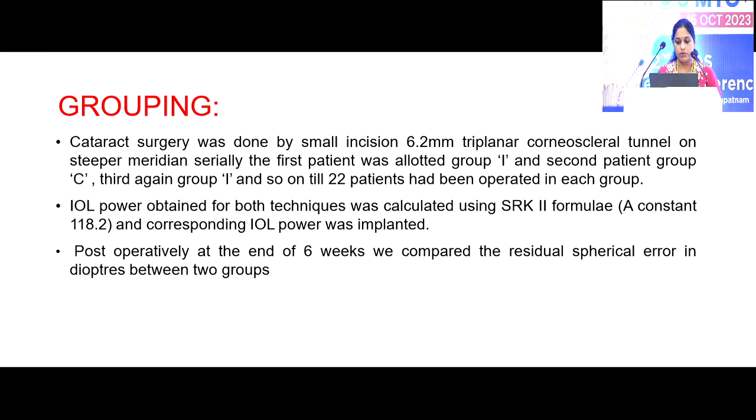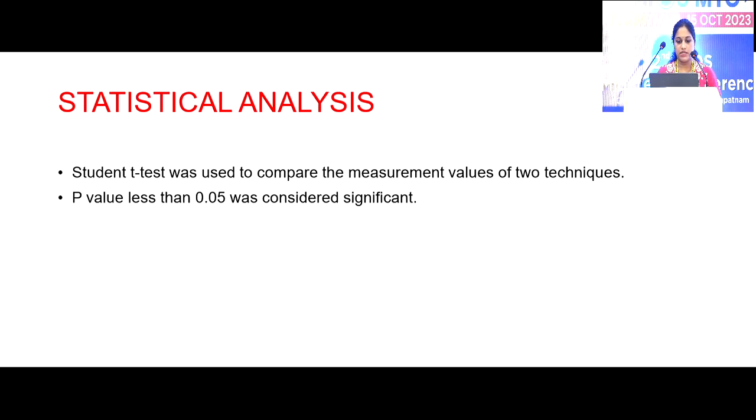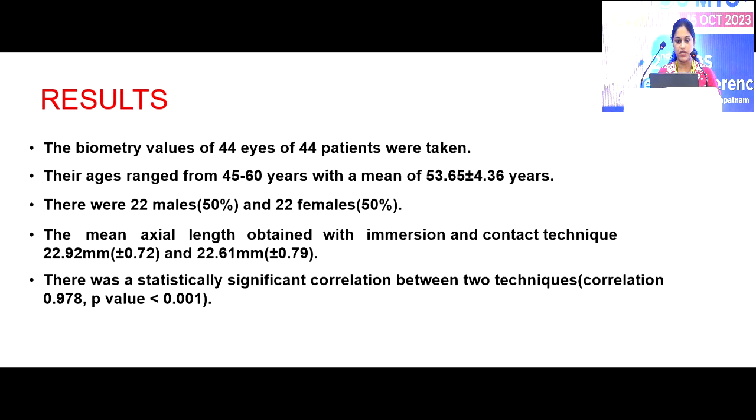IOL power obtained for both techniques was calculated using SRK2 formula. Postoperatively, at the end of 6 weeks, we compared the residual spherical error in diopters between two groups. Statistical analysis: student t-test was used and p-value less than 0.05 was considered significant.